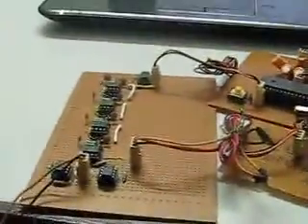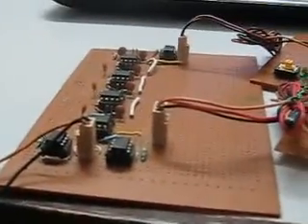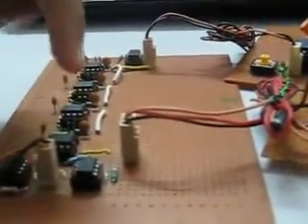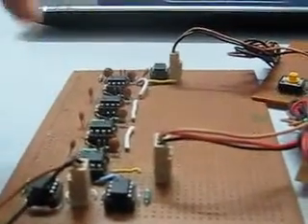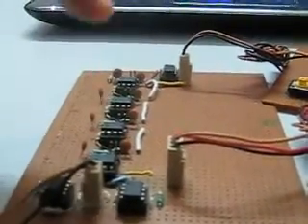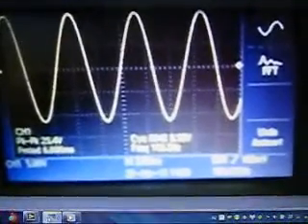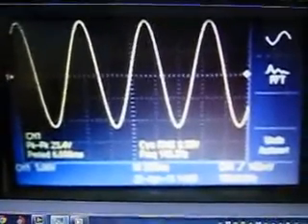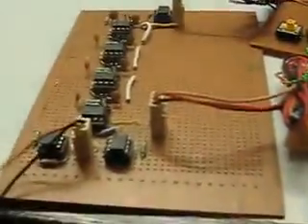Now, for this, we first have to design the data acquisition system. For that, we have made three circuits, and the first one is the power supply, which gives power to the circuits. Now, first we have to supply the ECG signal to the ECG amplifier. This is the instrumentation amplifier whose gain is 1110, and by checking the signals in a CRO, we get a signal like this. The ECG signal we give is in millivolts, but due to the gain, we are getting this high voltage.